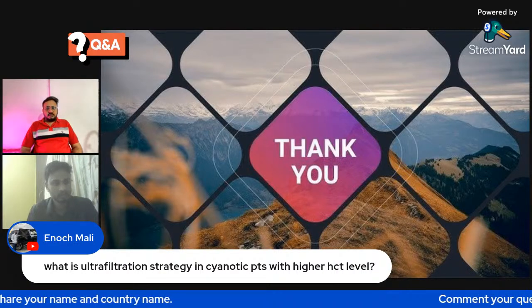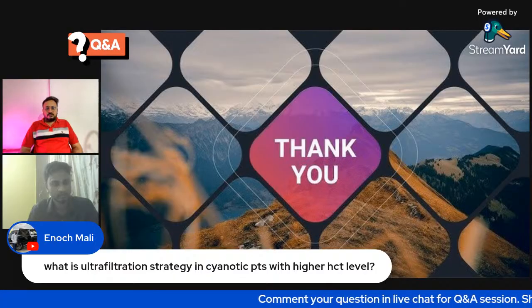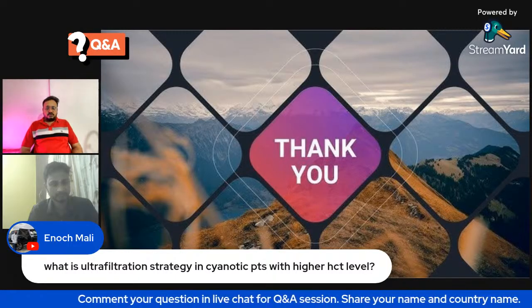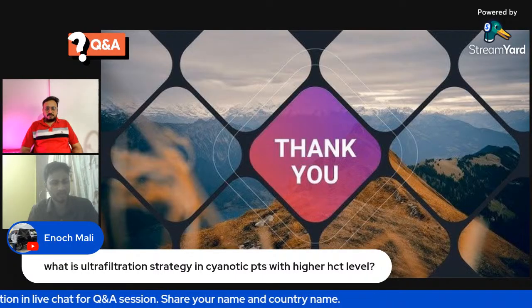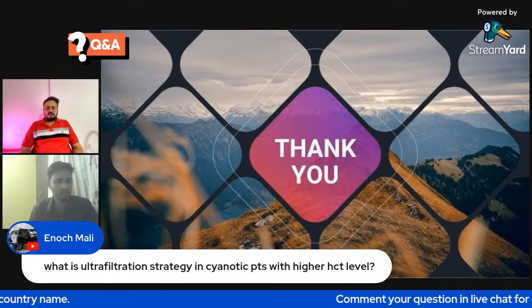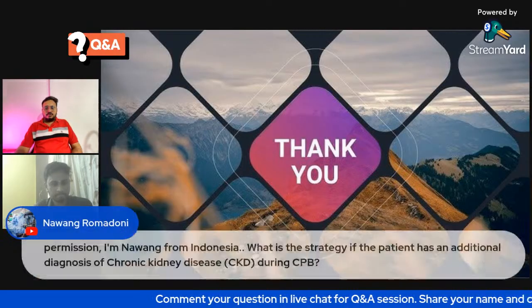If we are doing cuff and muff, I think we are removing most of the fluid. So is ZBUF necessary? No, sir, not necessary, but because of inflammatory mediators, to remove them we will do it during the rewarming time. Not necessary. Okay. We have one more question.